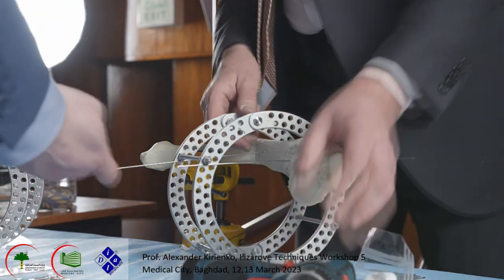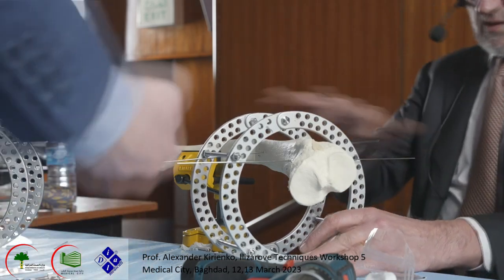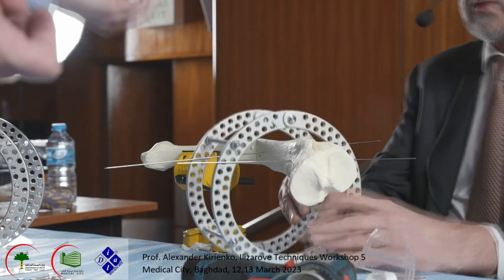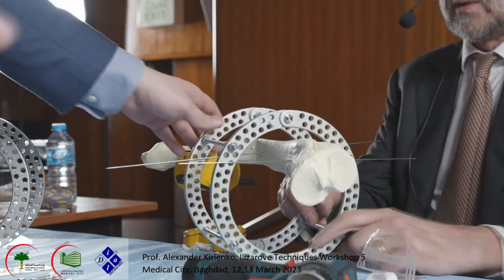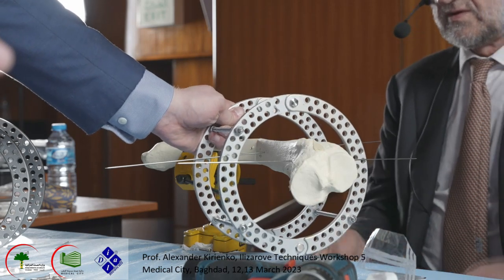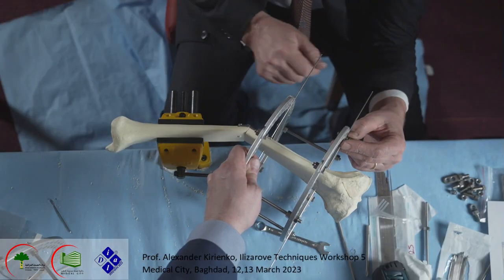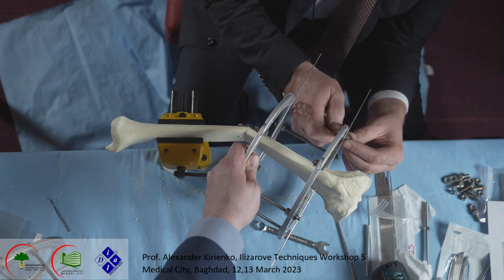Okay. And now we build the frame, because unfortunately for us, the patient doesn't have procurvatum or recurvatum. Keep the frame like this. Now we start to attach it. Like I said before, this connection bolt should be anterior.